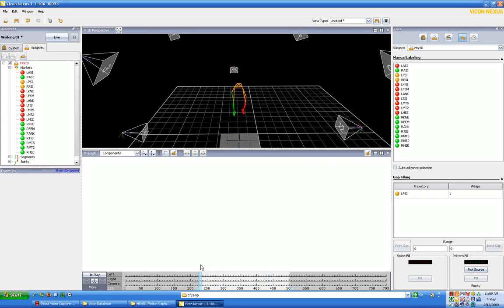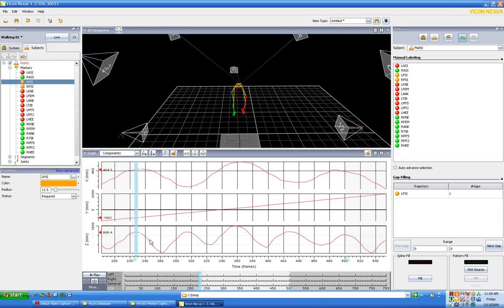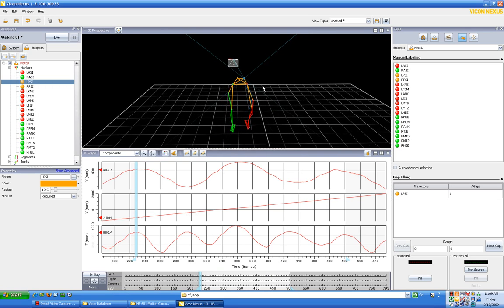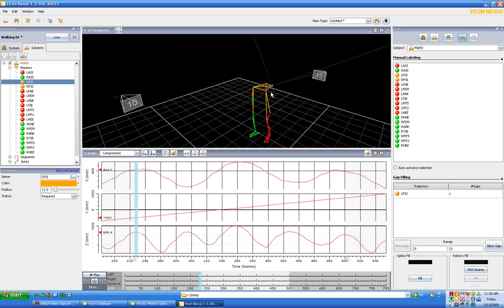But if we click on this dot, remember we had the one frame where it wasn't there. So this is what the program does - it's kind of like magic, but it's not really. It's going to fill in this gap because we need to know where that dot would be to run our model.